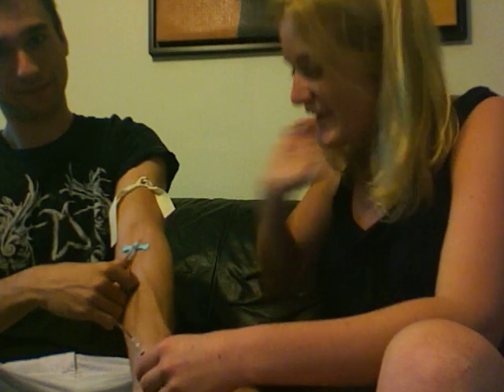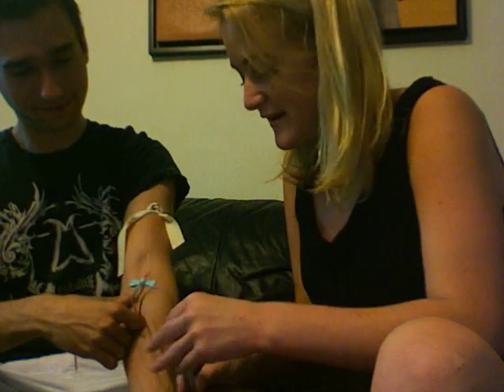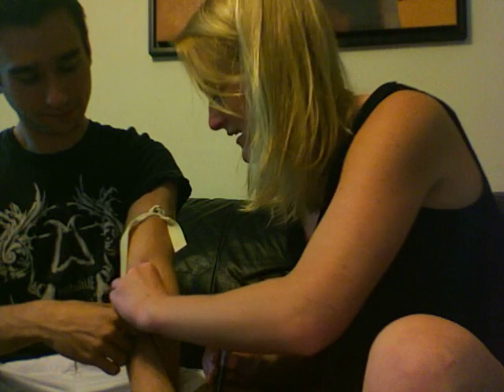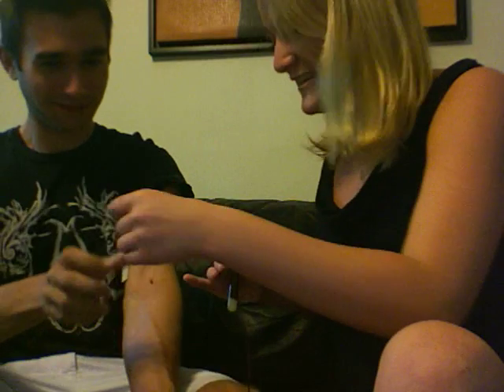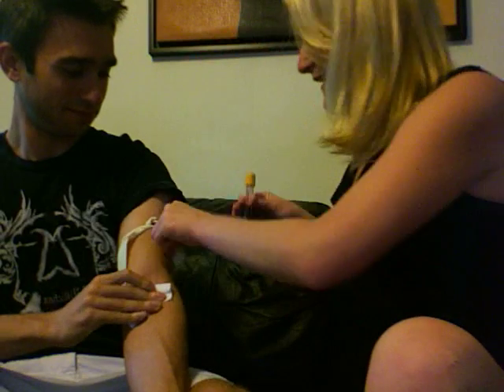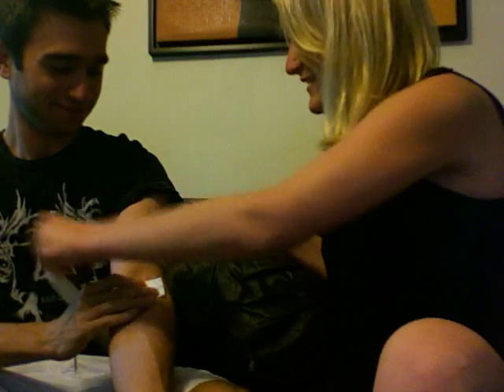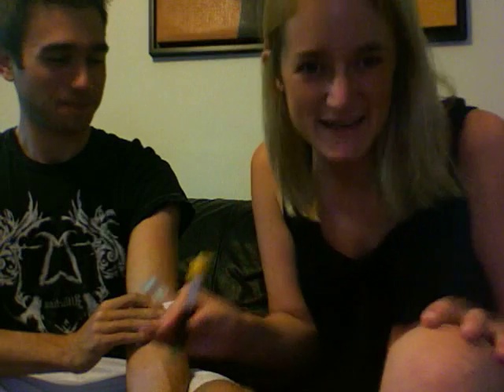Look. I'm just trying to show all of my fans. Okay, I think we're good. Should I just press the button? Pull that out first, and then I press the button. Look, I got you gauze this time. Thanks, girl. Oh, the tourniquet. Yay! So now I drew blood, and I have biohazards now. I'll put it in my biohazard bag — okay, success. Coming to you, Africa.